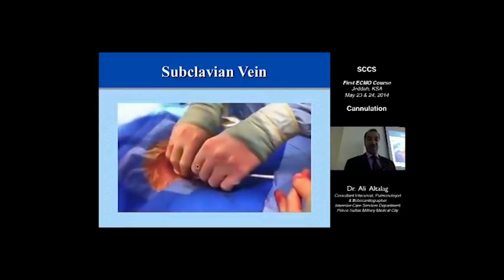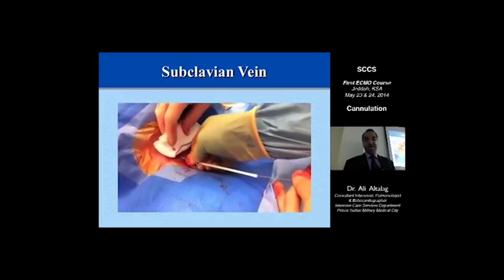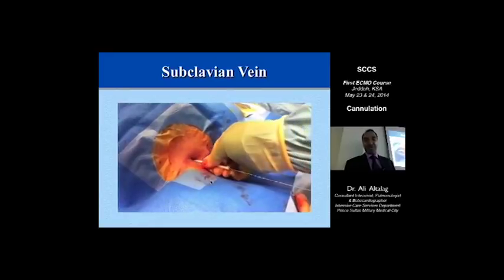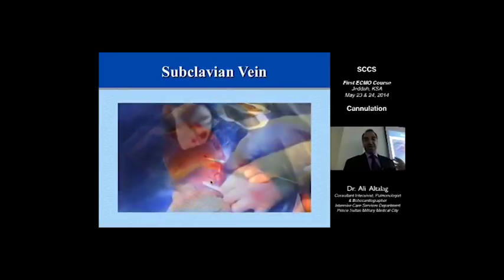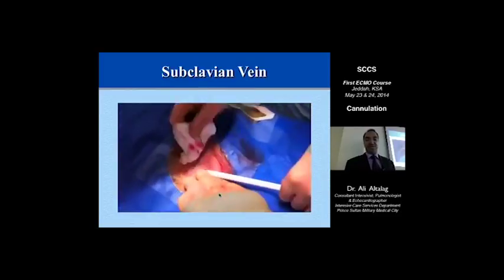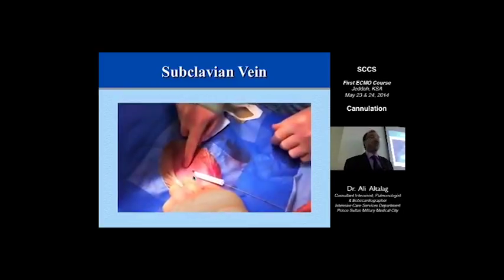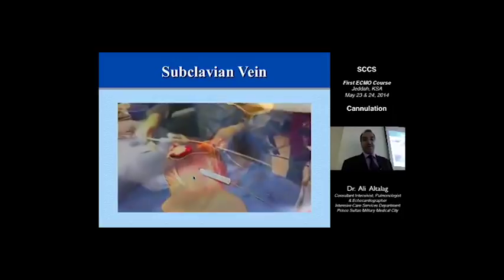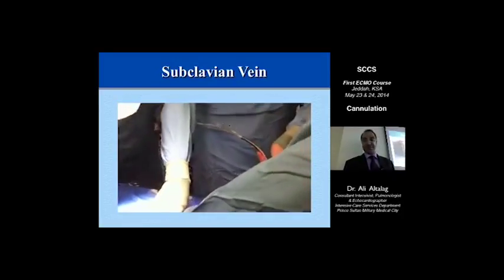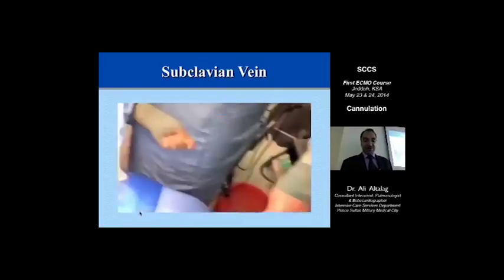If you have fluoroscopy, you can even see where the dilator is going. And a slow and nice rotational motion is probably necessary as well. And then just go on and on until you get the biggest dilator, which is the last one, and just pass it through, and then you are ready to pass the catheter with its dilator. So there's a dilator in the catheter. You see how long the guide wire is, and then you pass the Avalon catheter just close to the incision.